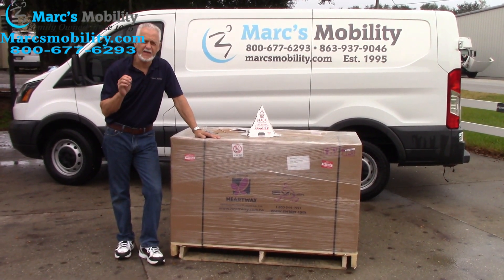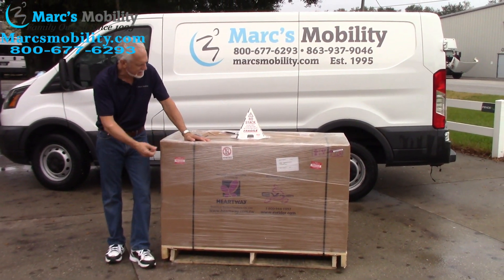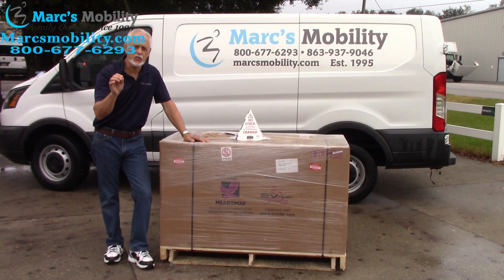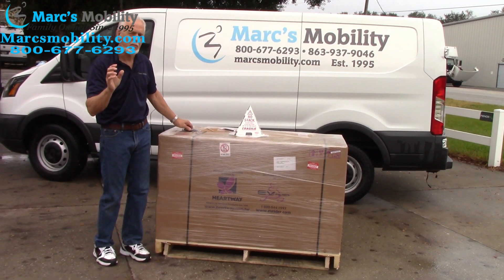We have here the Vita Express mobility scooter. This is how it would come to you in this type of box, just like this, on a pallet like this. It's called the Vita Express. Now be careful, there's a lot of Vita scooters out there. This is the Vita Express four-wheel scooter and we're going to show you how to get it out of the box.